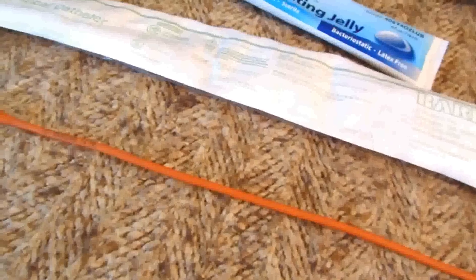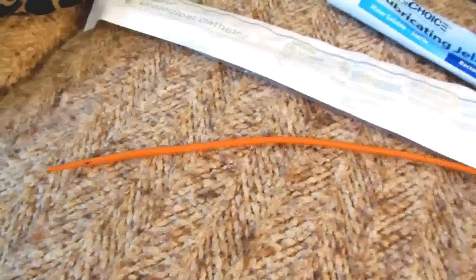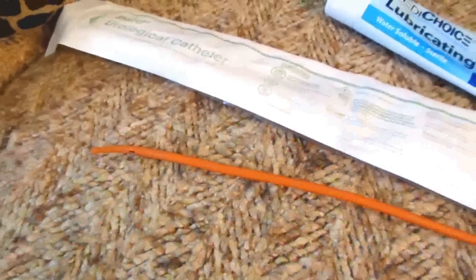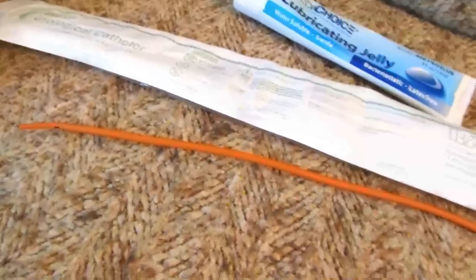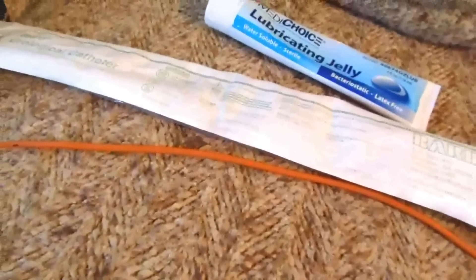It's very simple: this end goes in first, and the curvature follows the body. To keep that curvature going upward, the nub on the end faces your nose as you insert it. Make sure it's thoroughly lubed and it goes in very easily — it's not painful. All the talk about it being painful is exaggerated; with lubricating jelly it's not painful. For all the time I waited in the ER, I could have done this in three minutes flat.